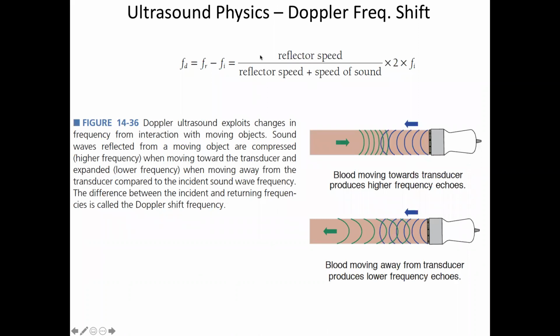So now we'll take a look at this Doppler effect. It's used a ton in ultrasound. It's not just in cardiac, but also in peripheral artery imaging, imaging in the carotids, and anywhere where you have flow and you want to see what the peak flow is or such.